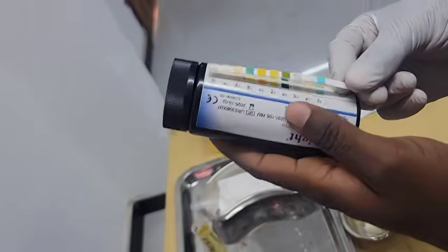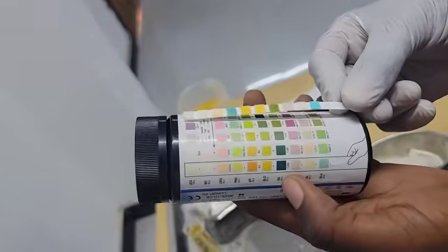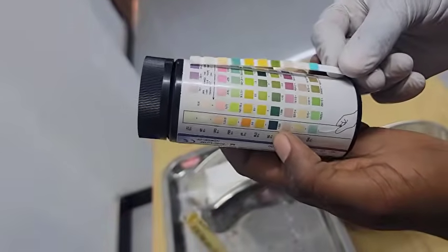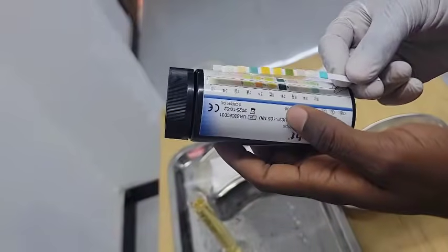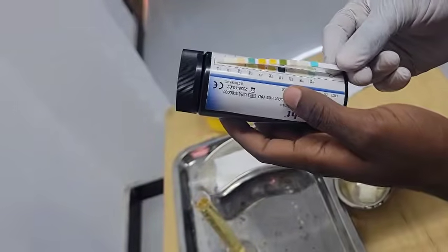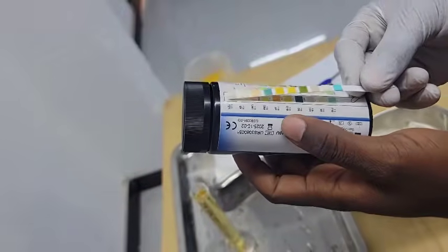So specific gravity at 45 seconds, it has changed, of course. It's 1.020. 1.020. You move to the next one, which is blood at 60 seconds. So blood, it hasn't changed. It's negative. You move to the next one, which is pH at 60 seconds.